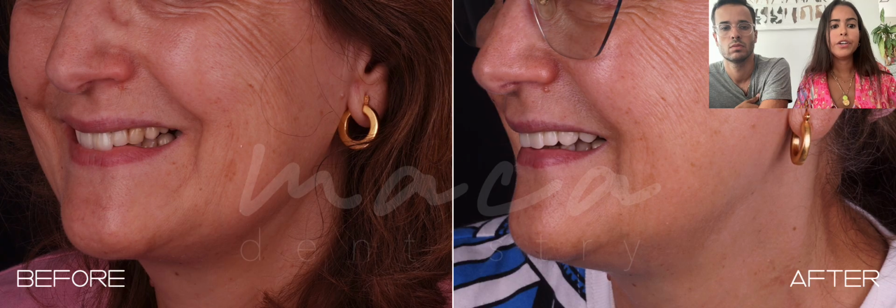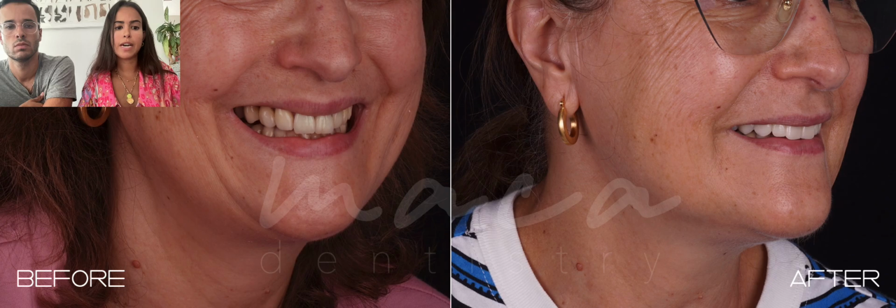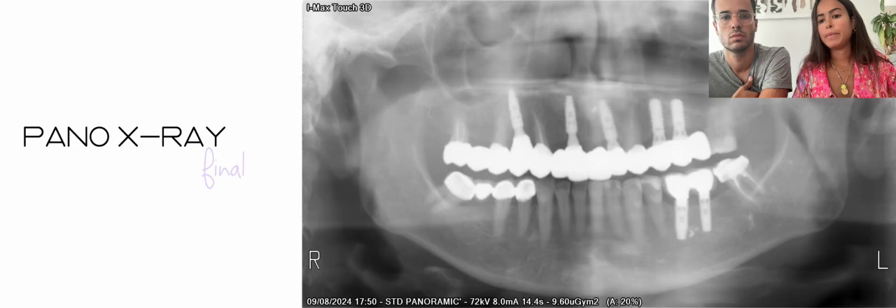Extraoral photographs before and after, front view. You can see that we managed to correct the position of the upper midline, to improve the shape and proportion of the teeth, and to create a space for the right lateral incisor that was missing, obtaining a very harmonious and aesthetically pleasant smile. Here the lateral view, left side and right side, and the final panoramic X-ray.